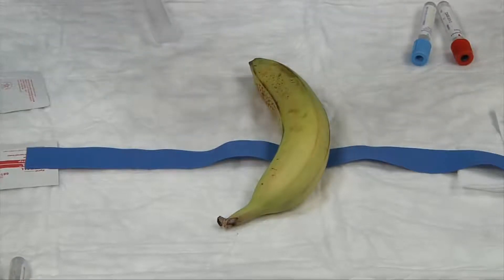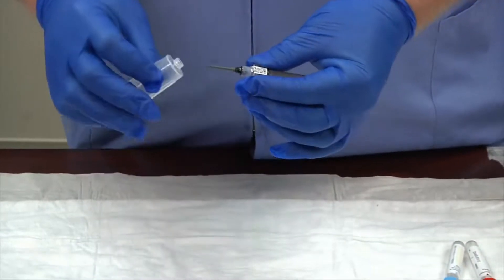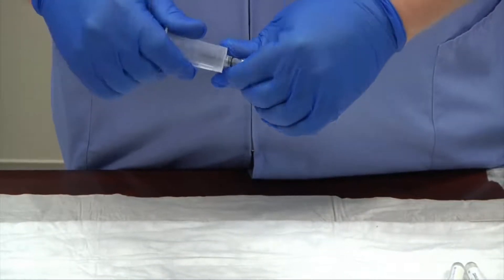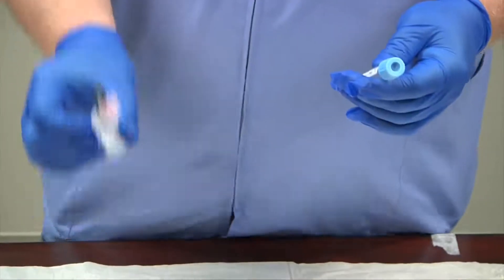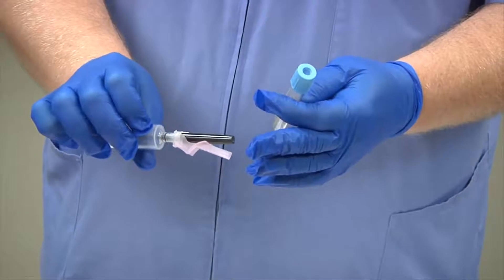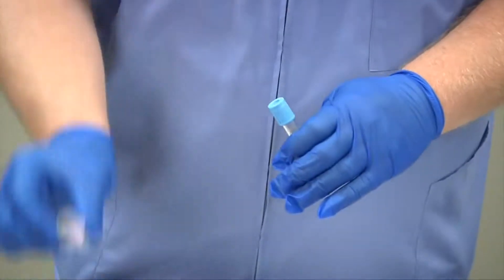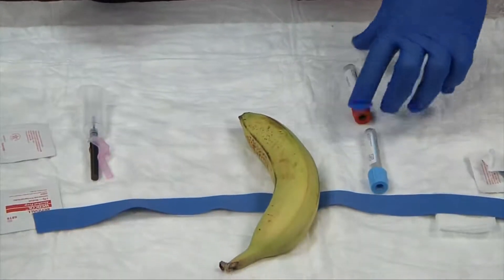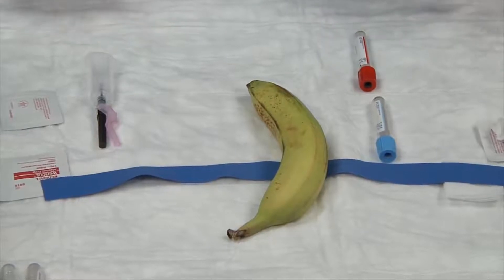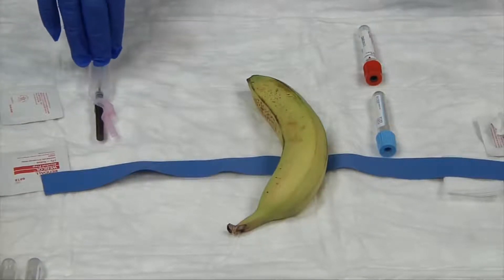As the alcohol swab is drying, I'm going to assemble my needle. While assembling, I'm checking to make sure it's still in date — and it is — and that the seal was intact. I tear off the end of the multi-sample needle, insert it into my holder, and tighten carefully. I'm also checking that my tubes are in date. Needles can expire — their sterility can expire — so we want to check the label on the needle packaging and make sure the paper sticker is intact. The most common issue with an expired tube is that it loses its vacuum suction, so never use expired tubes or expired needles, since the guarantee of sterility is no longer there.